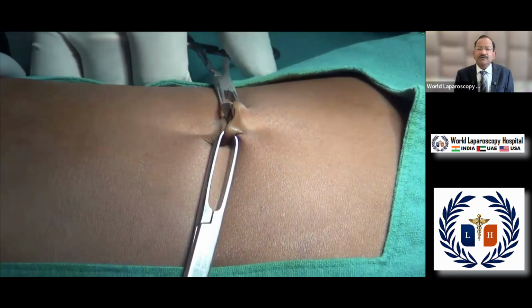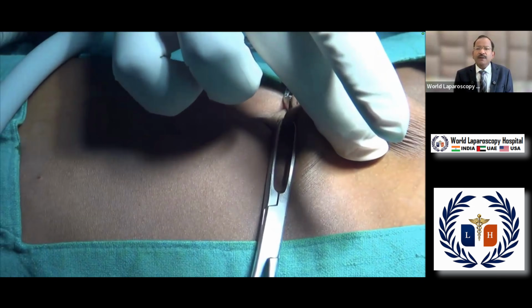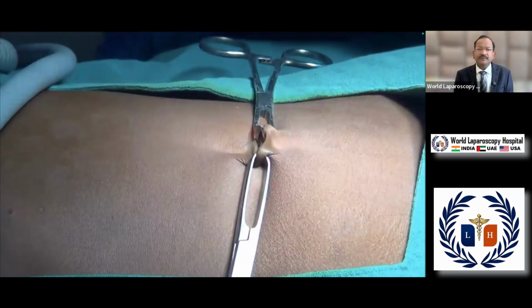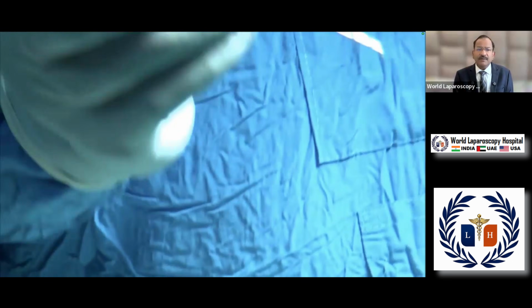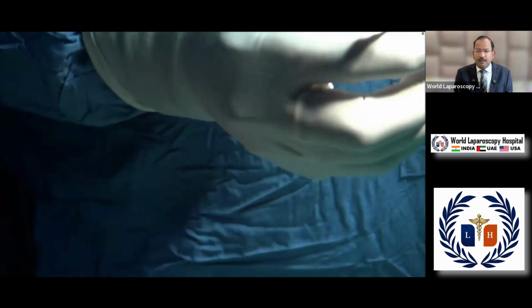After that you will measure the thickness of the abdominal wall, and 4 plus the thickness of the abdominal wall is the amount of Veress needle that should be naked.